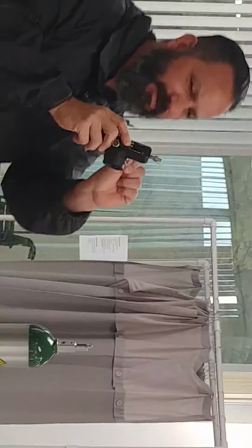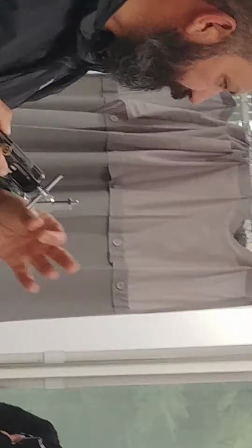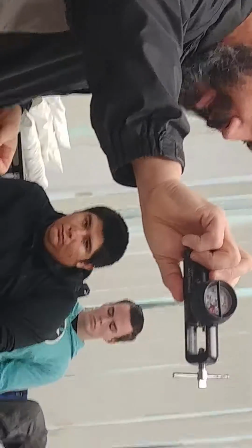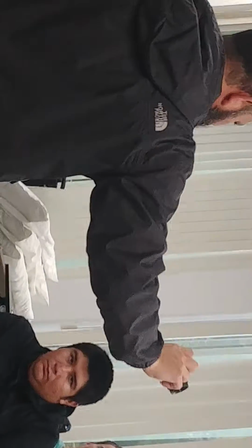If you notice, I'm going to lift it up. There is an O-ring, a gasket. This little gasket needs to be present. What are gaskets for? Proper sealing, correct? If you look at the center of it without the gasket, it's just going to look like that. Look at what it looks like without the gasket. You see that?